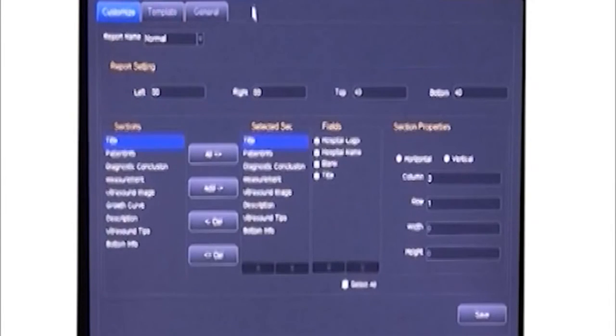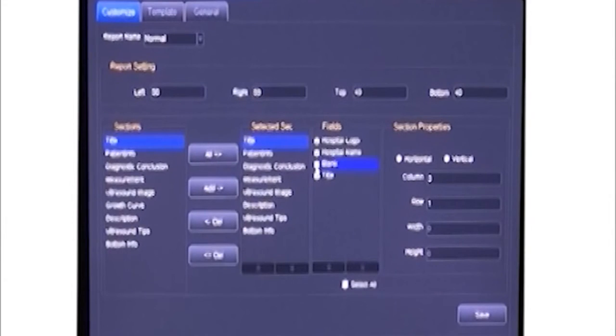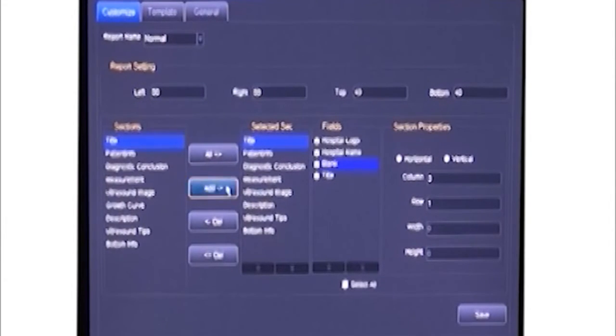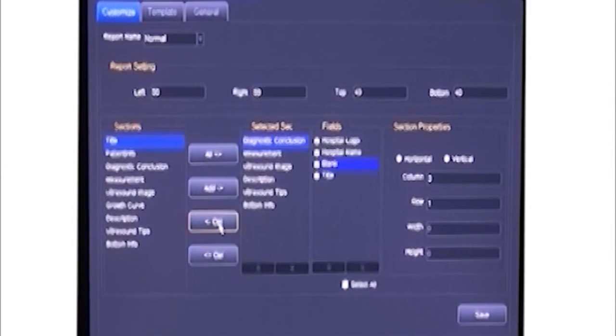For the report format, we can also edit. Here we can choose select sections. We can choose sections we want to show on the report and delete what we don't want.